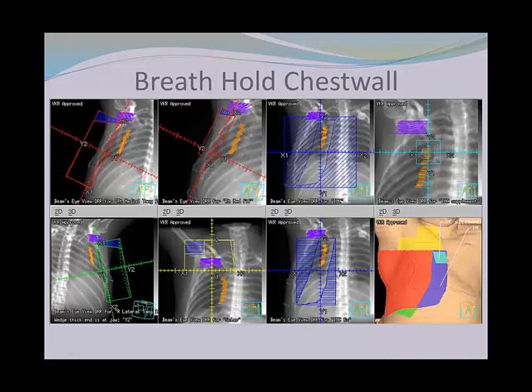And then special in this case is, even with 16 MeV, we're a little bit shy of the depth that we needed to cover the lymph nodes. And so what they did is add that supplemental field over here, and basically we just add enough dose in there to make sure to get the coverage that we needed posteriorly for those IMC lymph nodes.